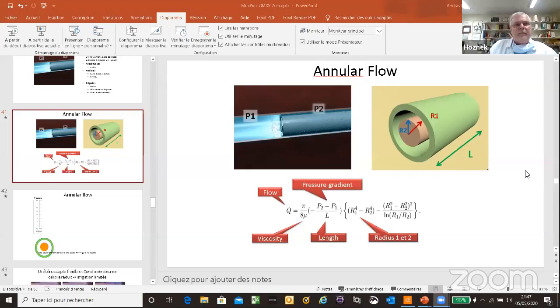Now you can also have suction with the mini perc because you have the so-called Clear Petra device, which can aspirate the irrigation fluid. But I would like to react concerning this question of pressure, intrarenal pressure, because some people tell, I don't know whether I can show you some slides. Yes, of course. So how can I share the screen? Okay. Do you see this? Yeah, I can see your screen.